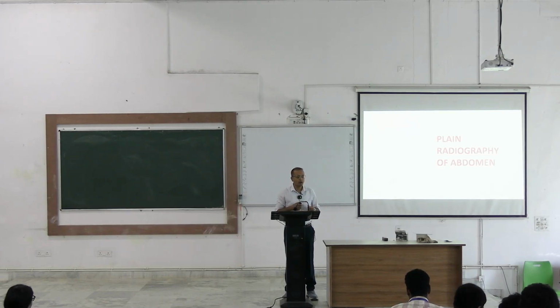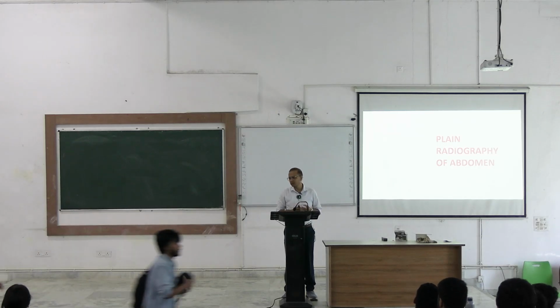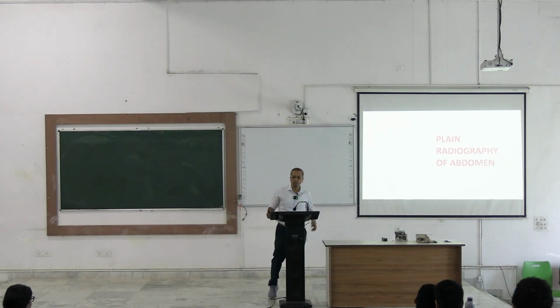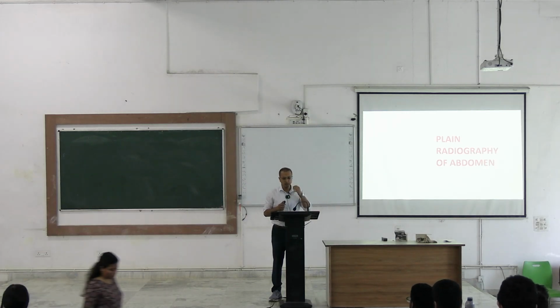So we are going to have a small session on radiology of abdomen. We have covered these radiology sessions in different parts of the anatomy classes, like radiology of upper limb, lower limb, thorax, etc. So in abdomen, we are going to cover two sessions or two sections of radiological anatomy.